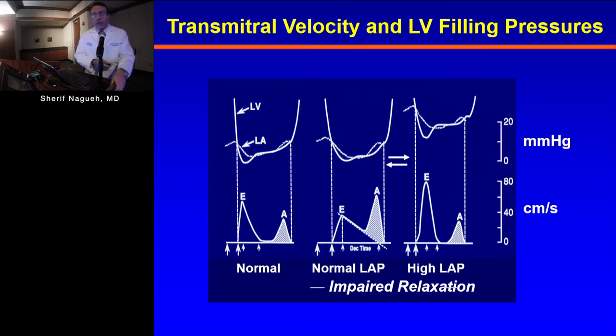We'll start with the mitral inflow. The mitral inflow follows the LA-LV pressure gradients that you saw in a normal heart. Typically, you have a rapid rise in the mitral E velocity and a rapid decline in the E velocity. We call the rise acceleration and the decline deceleration. We can measure acceleration time and deceleration time, or we can measure acceleration rate and deceleration rates. The rates, in addition to time intervals, include velocities.